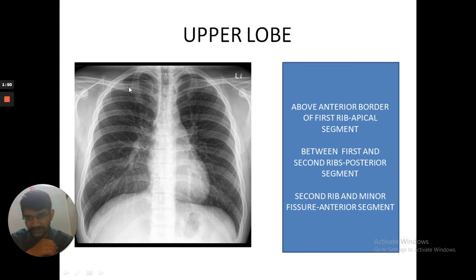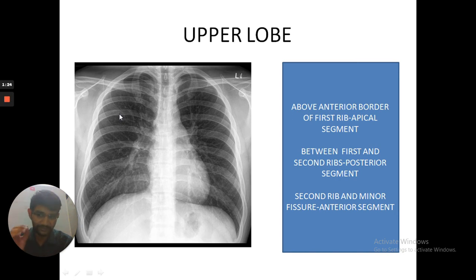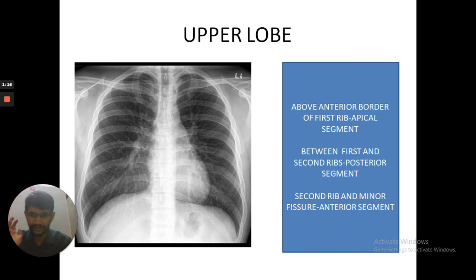If there is a lesion between the first and the second rib, then it is in the posterior segment of the upper lobe. If the lesion is between the second rib and the minor fissure, it is in the anterior segment of the upper lobe. The minor fissure runs at the third costal cartilage — it is a horizontal fissure. So: above first rib = apical; between first and second = posterior; between second rib and minor fissure = anterior segment.